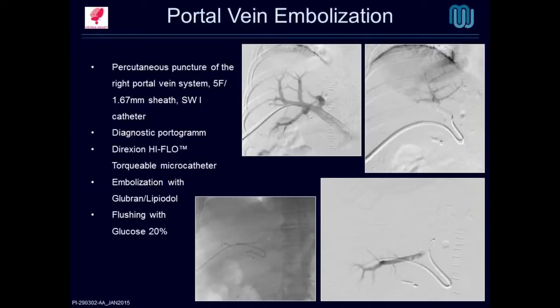I normally enter below the rib number 9 or number 10 in anterior to mid-axillary line with the needle pointing toward the central part of the liver. I remove the mandrel of the needle and connect the hollow needle with a syringe partly filled with contrast media. I slowly retract the needle until aspiring dark blood. Then I inject a very small amount of contrast media to confirm the right needle position in a branch of the portal vein and not in a liver vein. It can require several attempts to gain access.